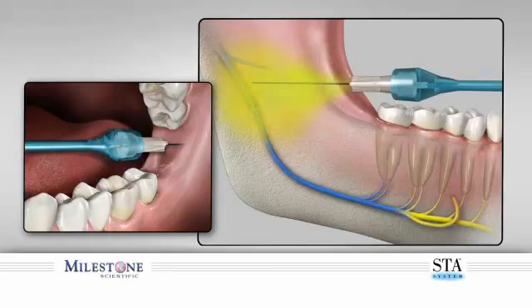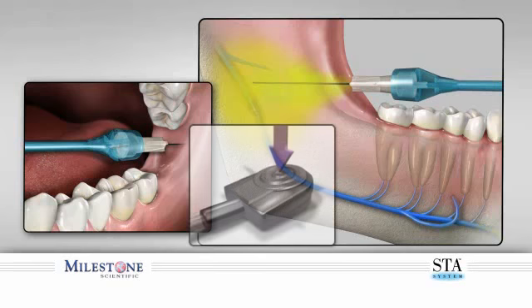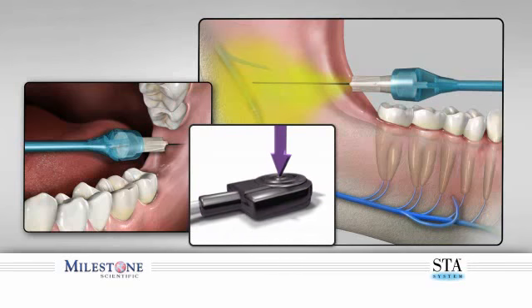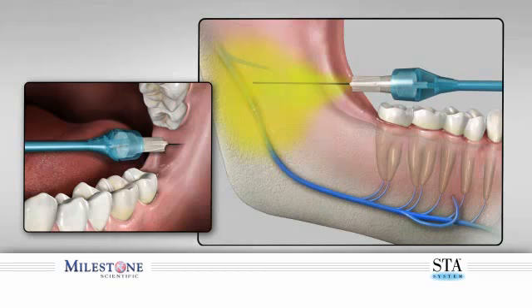Continue the injection by depressing the foot control pedal. It is recommended that the first 1/4 of the cartridge be dispensed using the control flow rate before you transition to the second faster rapid flow rate. The rapid flow rate is used during block injections, only after your patient has acknowledged that they have achieved soft tissue anesthesia of the area being injected. This is acknowledged by subjective statements elicited from your patient.